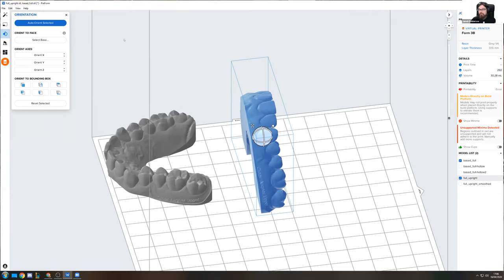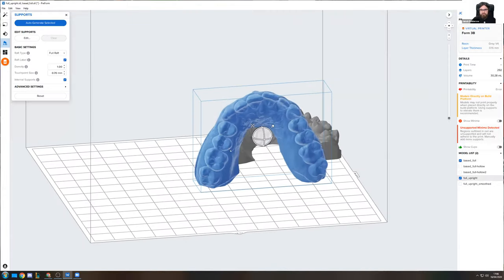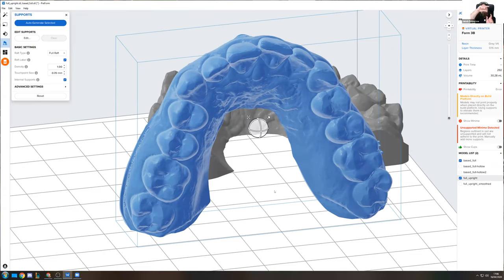So after we have decided on an orientation, as I said, either flat on the build platform or upright, the next step would be to go into the support settings right here. As you can see right up top, there is a button to automatically generate all the supports. For something like this model on the left here, where I have it just flat on the build platform, I will not need any supports. But for something that is upright like this arch right here, I will every once in a while need a couple of supports just to support the arch itself so that it prints in the best way possible.